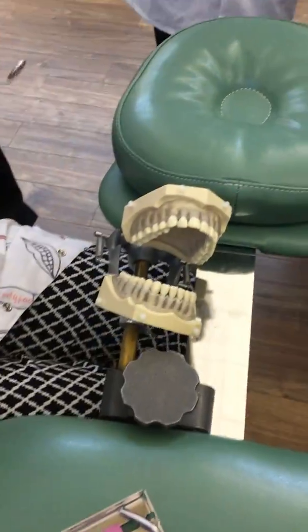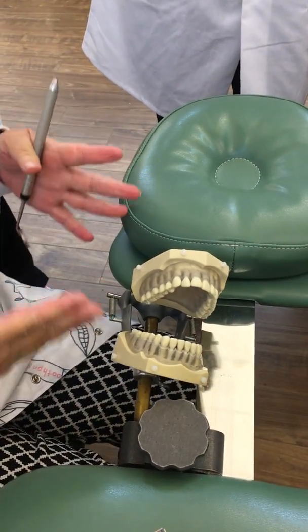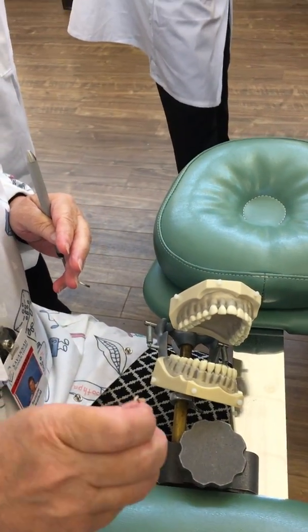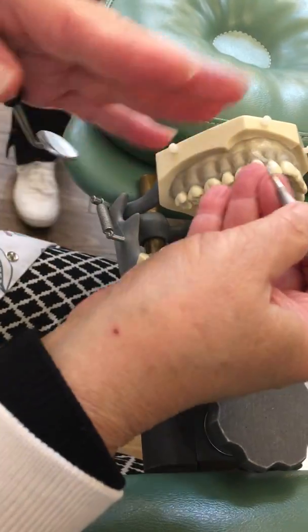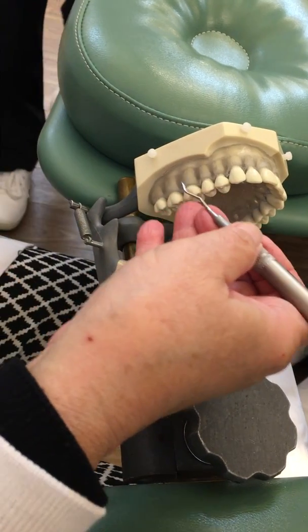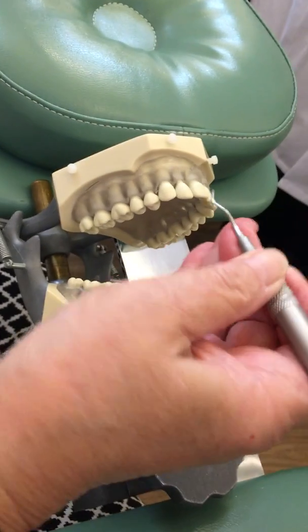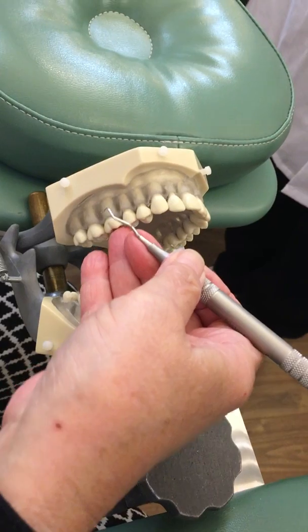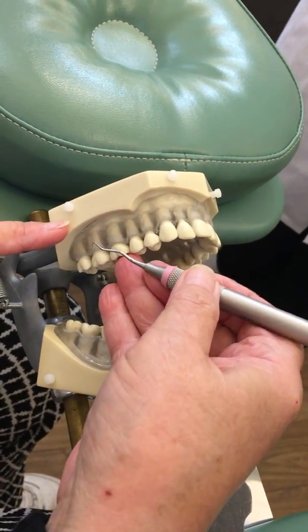For areas five and six, we're going to turn the patient or the mannequin away from us. We're going to move down to about nine o'clock and go back to our 13-14 Gracey, which is our distal instrument. Remember on the maxilla, palm is up. My second finger is kind of tucked inside my fulcrum. I'm going to stretch my fulcrum up and place it on my first molar here, which is tooth number three.